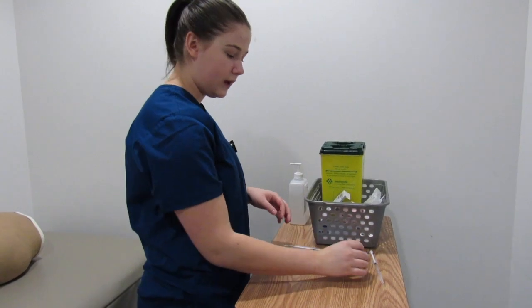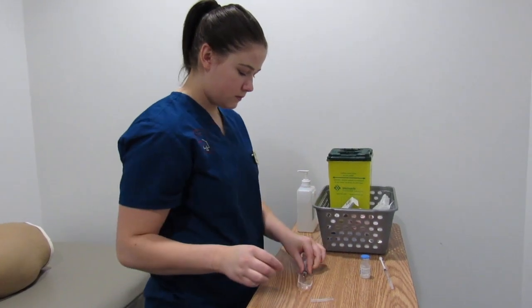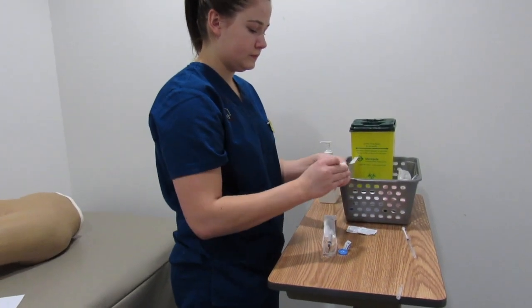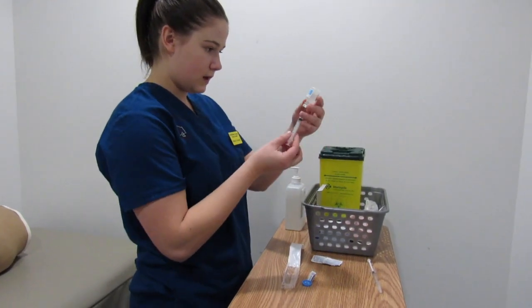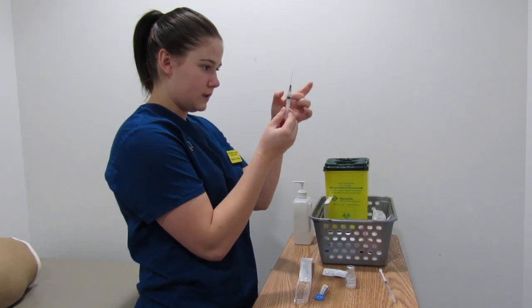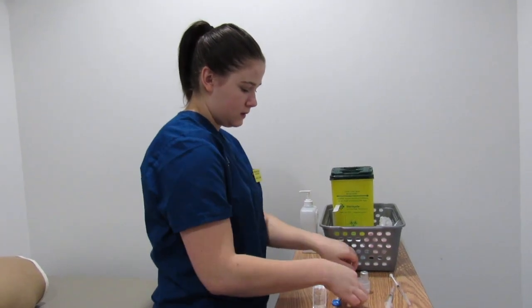So I've now grabbed a 2 milliliter vial of Haldol, and I'm going to open up the syringe, attach the needle to the syringe, remove the cap, and before that I'm going to clean the vial. And for this one, I'm going to withdraw 0.5 milliliters of the Haldol. Again, I'm just going to make sure I get all the air bubbles out before I place the cap back on. And now I'm ready to go in.